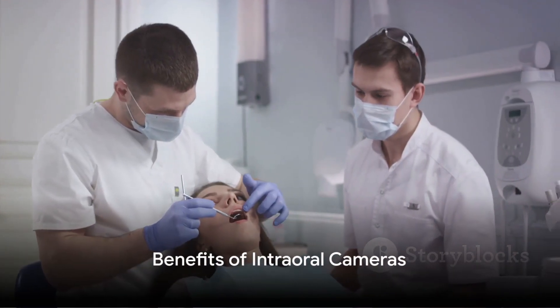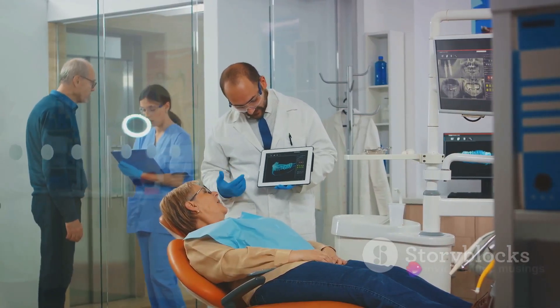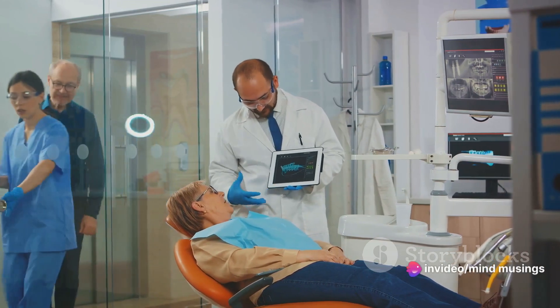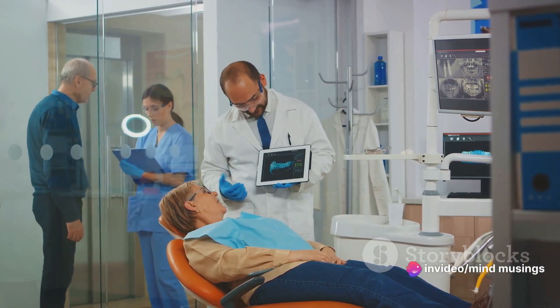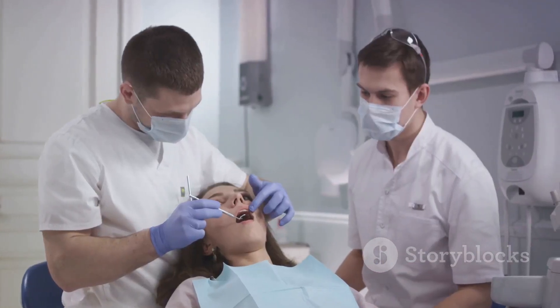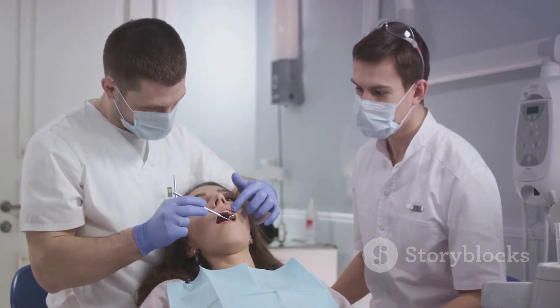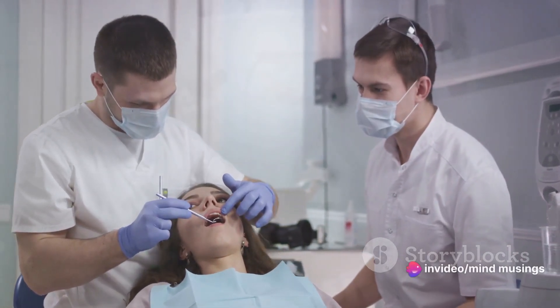But how does this benefit you? Well, with an intraoral camera, your dentist can show you exactly what they see. They can highlight areas of concern, explain the issue, and discuss treatment options. This visual aid can make complex dental issues easier to understand, empowering you to make informed decisions about your oral health.